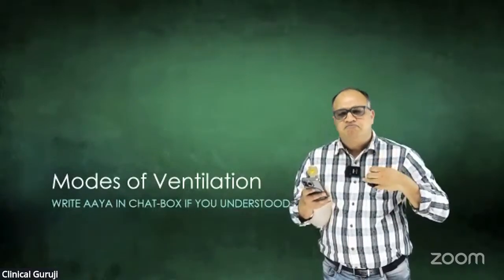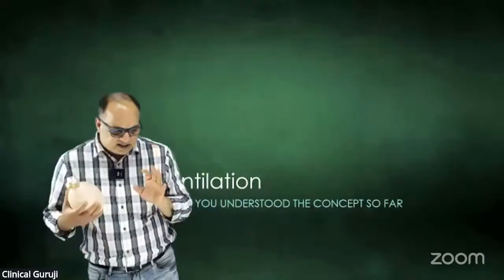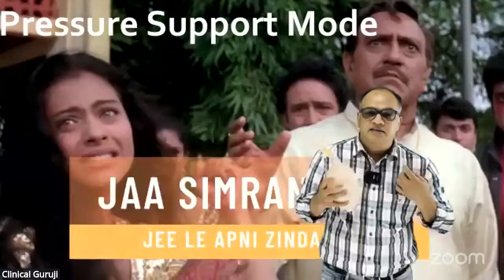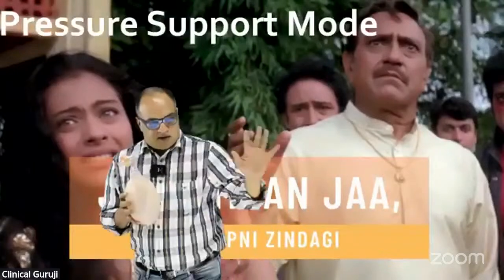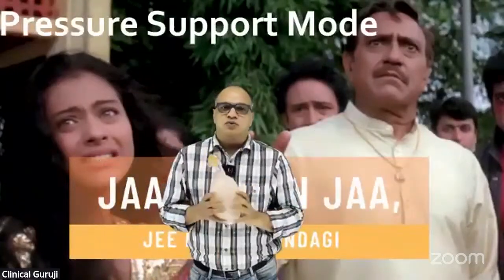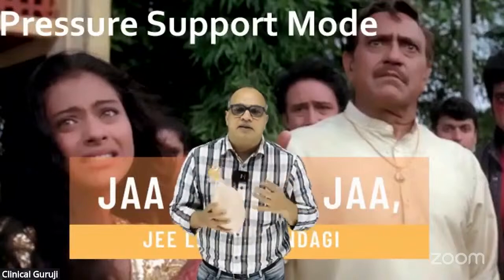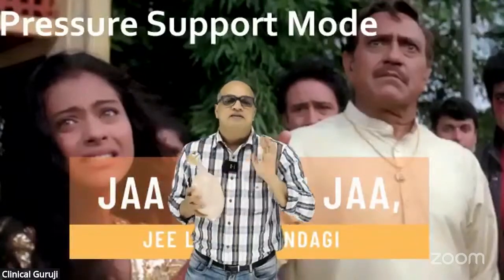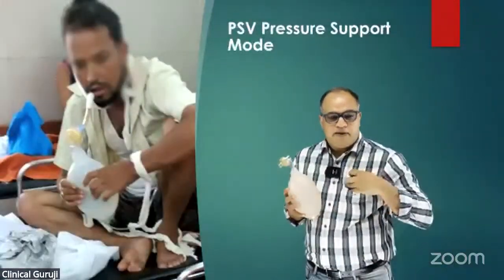So this time again, Ramadhir said that no, this is not working. Let's respect every breath of the patient. Fine. You are giving volutrauma, you are hyperventilating the patient. Let's not do that. Let the patient breathe on his own. So this time the mode was defined as pressure support mode. The ventilator was told to sit idly and wait for the patient to trigger a breath. When you breathe, only then will I give a breath. The mode was called pressure support mode, PSV.